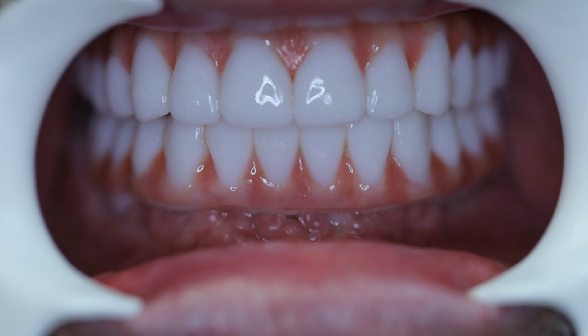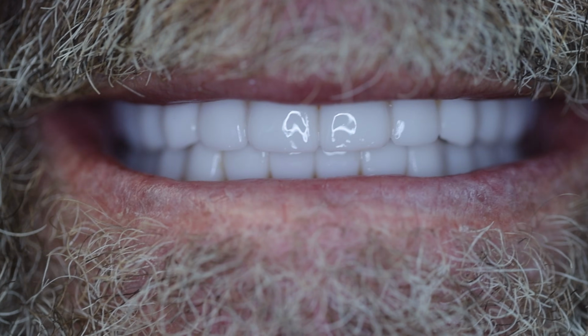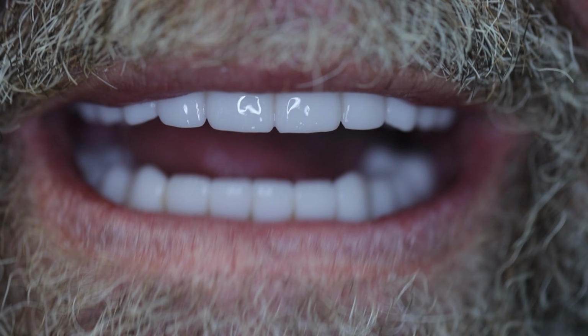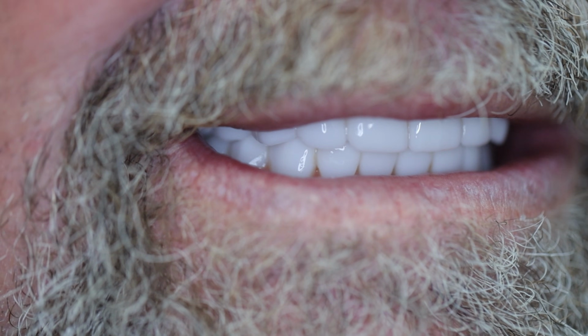The thought process behind this is, at this point, we can always go back to the previous designs or meet somewhere in the middle for the final prosthesis. And that is easier than just trying to make little changes by little changes until we get to the point that they like it. It's best just to go big and then take it back some for the final prosthesis if we need to. And now with the new provisional dentures in place, this time we send the patient on the way for another 3 weeks or so.